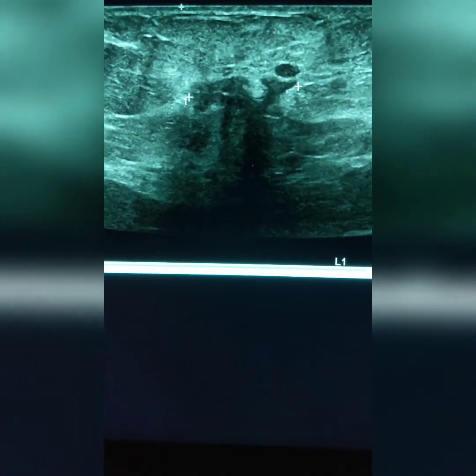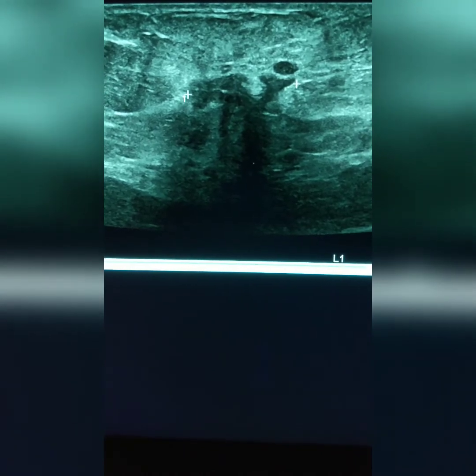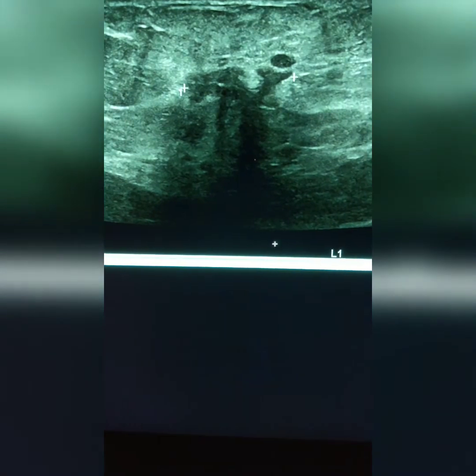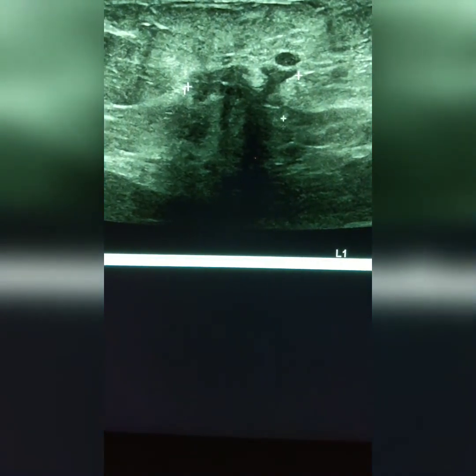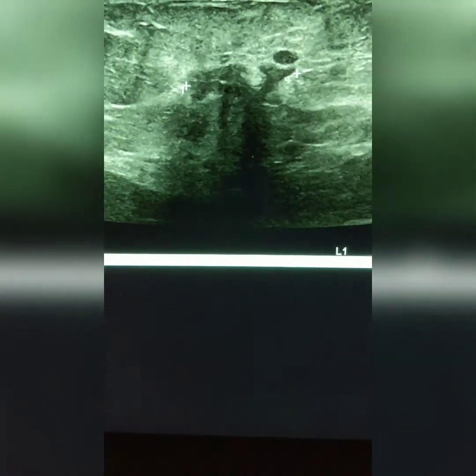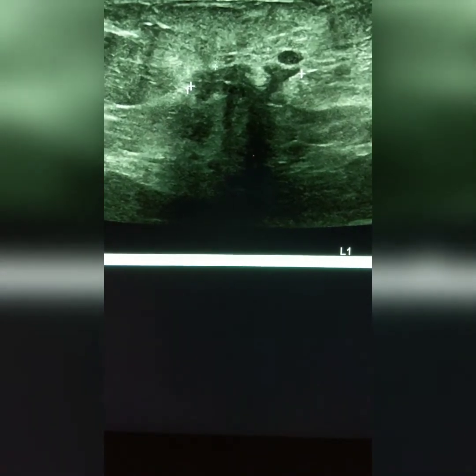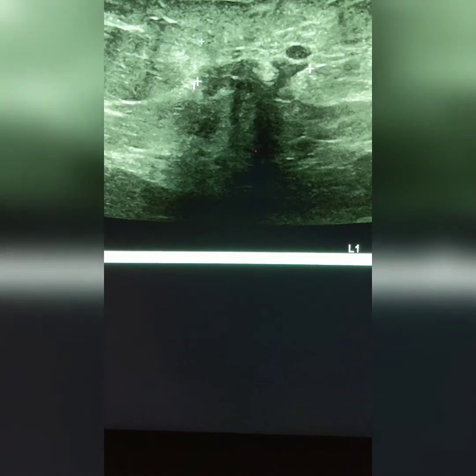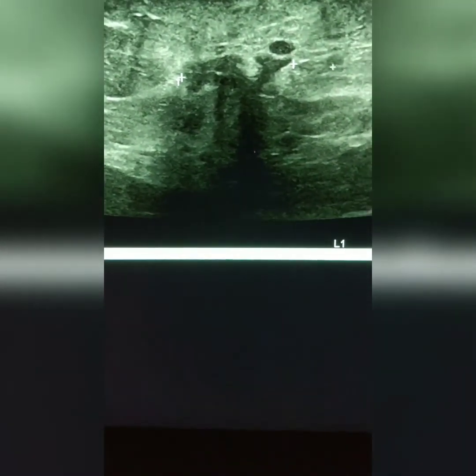So on ultrasound, here's the patient's skin surface. The ultrasound probe comes down on their skin, shoots sound waves through, which reflect back, or sometimes they don't reflect back depending on what we are looking at, and that creates the image. The computer generates this image. So this is normal breast tissue, or I should say fatty breast tissue. In this lady, it's pretty much all fat.